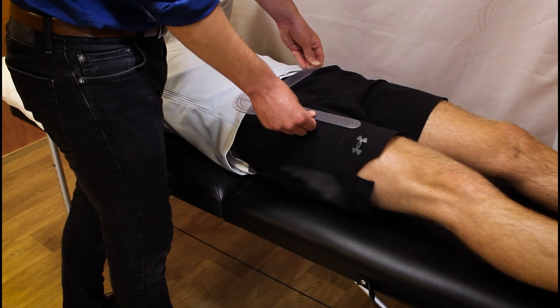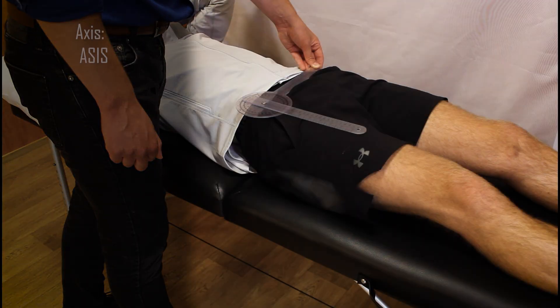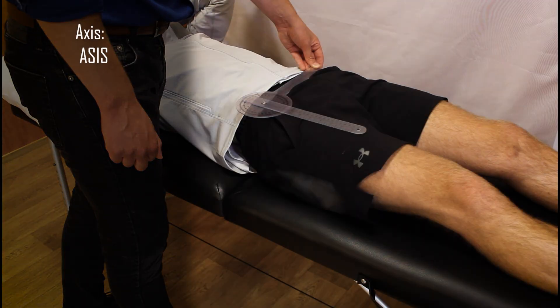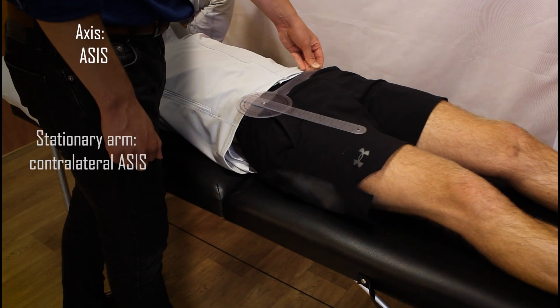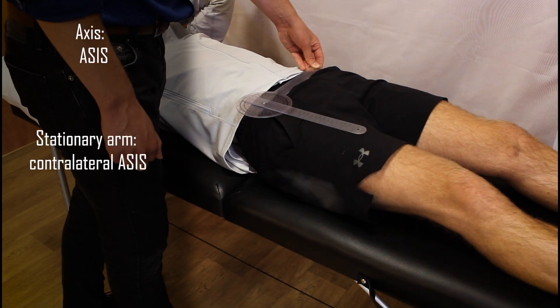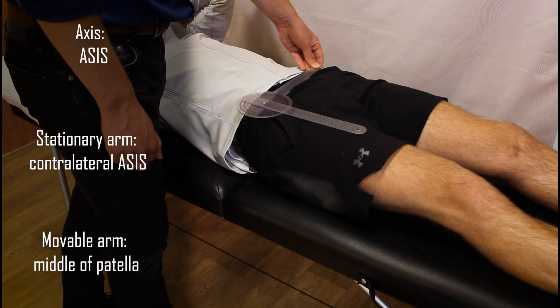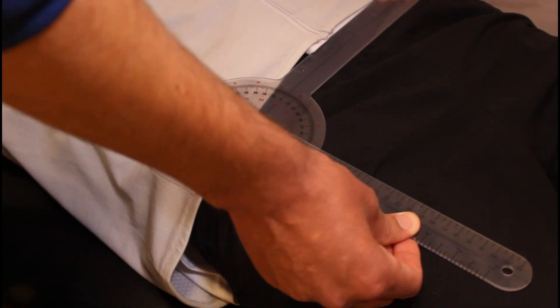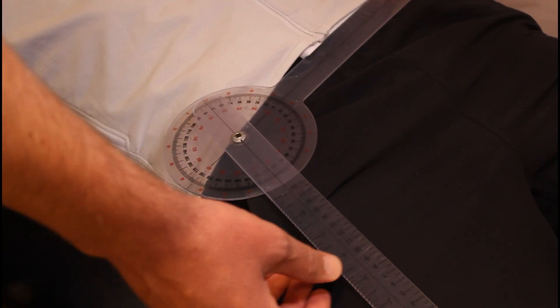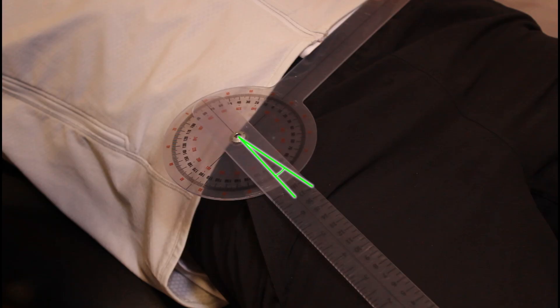To measure hip abduction, the patient is positioned in supine. The axis of the goniometer is placed over the anterior superior iliac spine, ASIS, with the stationary arm pointing to the contralateral ASIS and the movable arm parallel to the femur pointing to the middle of the patella. Ask the patient to take their leg out sideways as far as possible and ensure they avoid any external rotation of the hip.